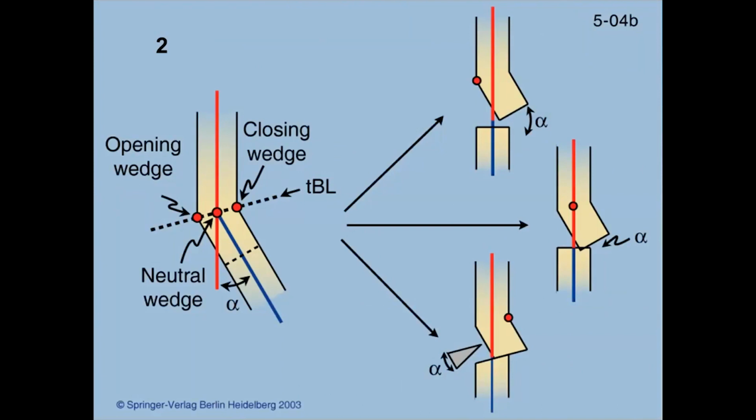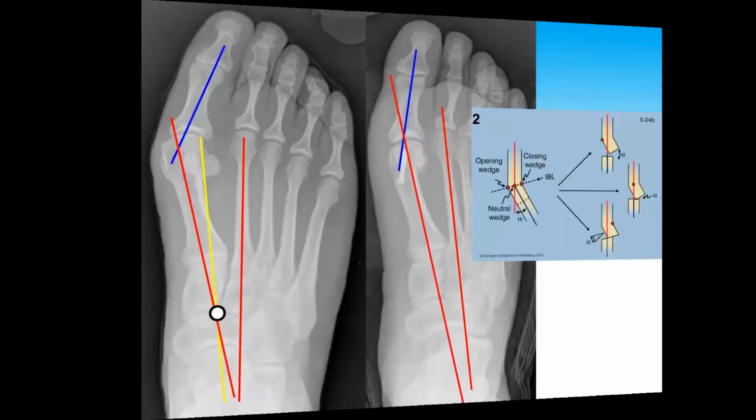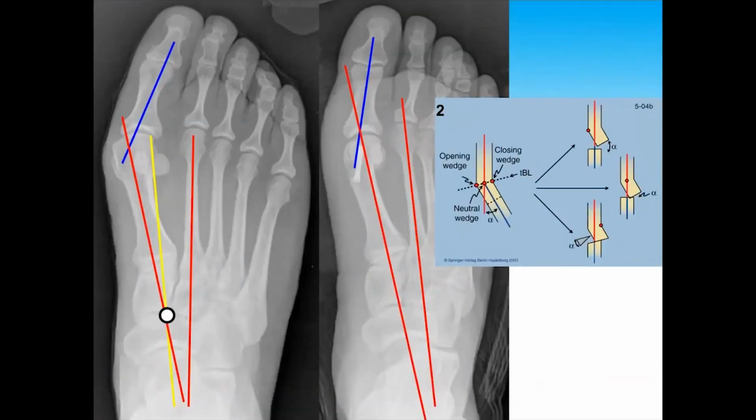and we can see that example in the hallux valgus deformity, where our CORA, or apex, is more in the midfoot region, and we cut the bone distal to the CORA, just as I showed in that Osteotomy Rule 2 example, and you have to translate the osteotomy laterally, in this case, the metatarsal neck osteotomy, in order to line up the red line on the yellow line.